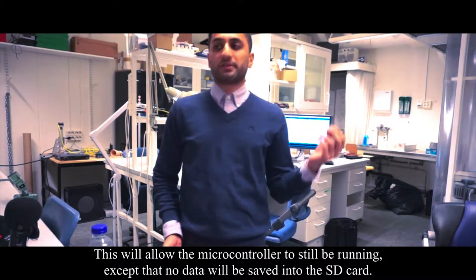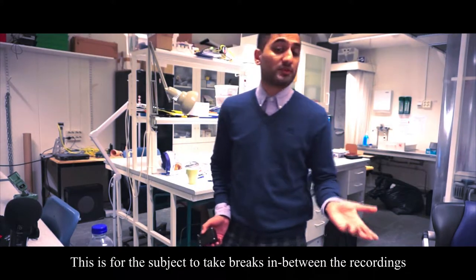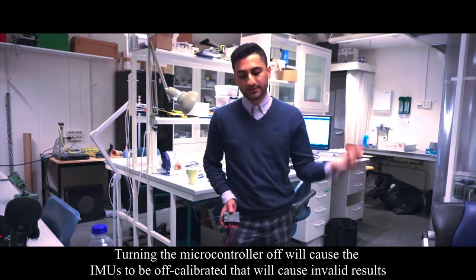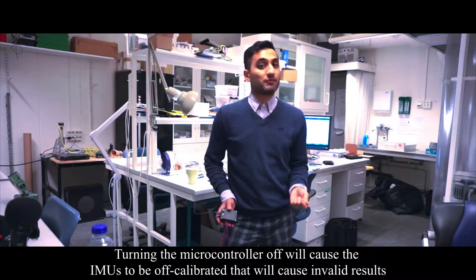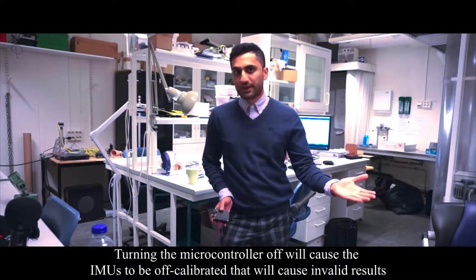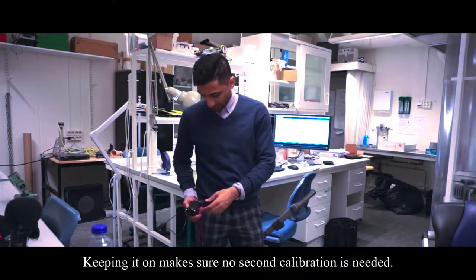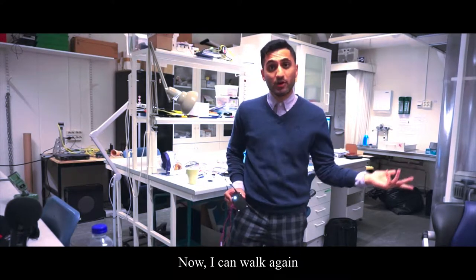If I want to take a break, I can just switch this button — the microcontroller is still running. This is mainly because for long-term measurements you might need a break or need to use the toilet. If you power it off and turn it back on you would have to recalibrate the IMU, and if not done properly the readings will get errors. When I press it again, I can walk again.